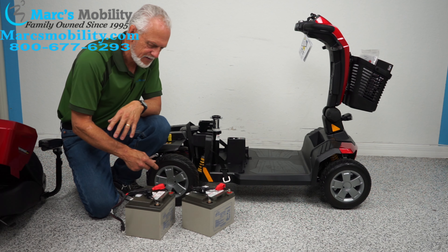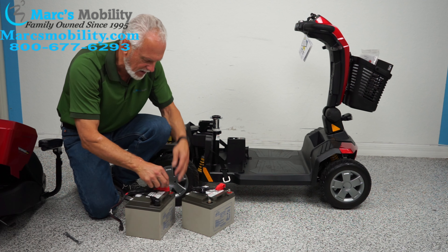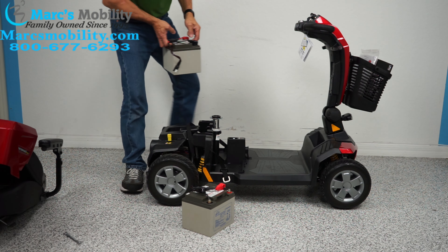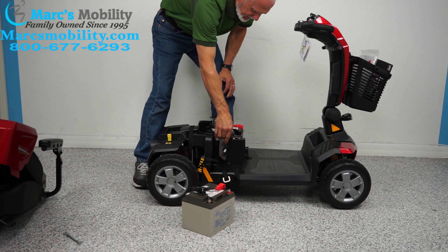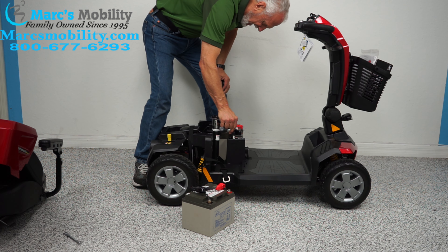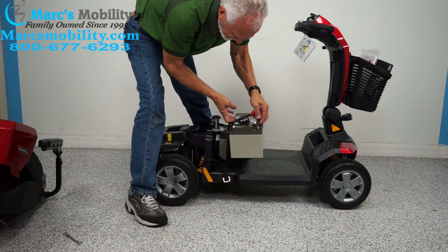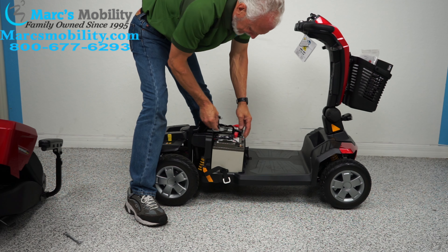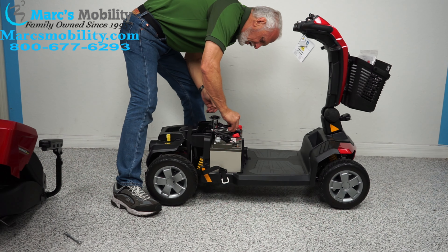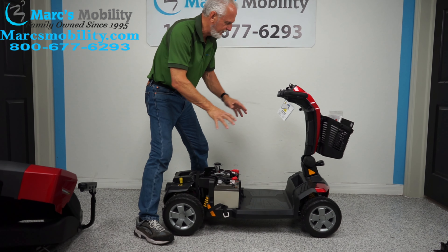If you're going to change the batteries, take the two batteries out, replace the cable, and then when you've got the cables on the new batteries, take your batteries — they're kind of heavy, so be careful — put them back in the slot, plug your cable right here. Do not force these cables, do not force them in there. Take your other battery, put it back in, take your cable, plug it in the middle. Turn your key on, make sure the power is on — that means everything is connected properly.